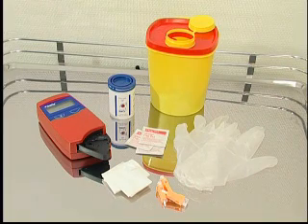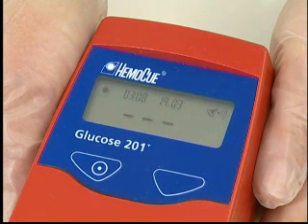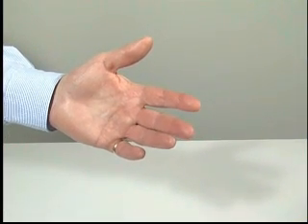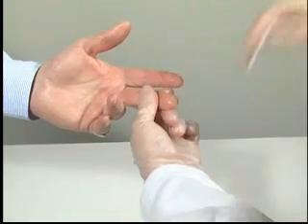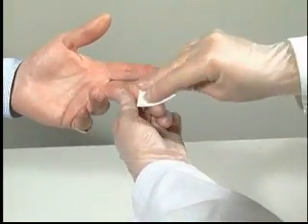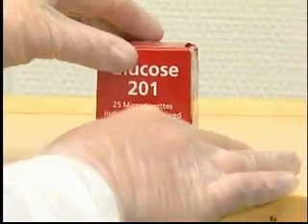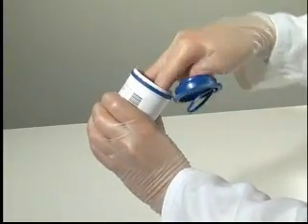Make sure that all the supplies are to hand. After start-up, the cuvette holder should be in its loading position and the display will show three flashing dashes and the HemeQ symbol. Make sure the patient's hand is warm and relaxed. Clean with disinfectant and allow to dry. Use only the middle or ring finger for sampling, and avoid fingers with rings on them. Take the micro-cuvette out of the package. If a vial is being used, close the lid immediately.